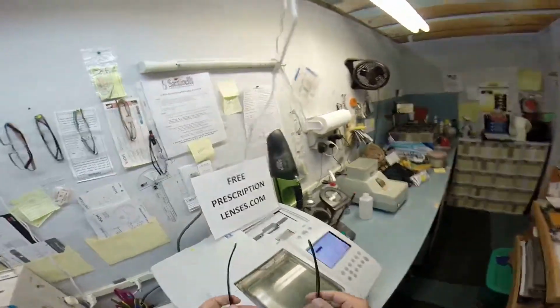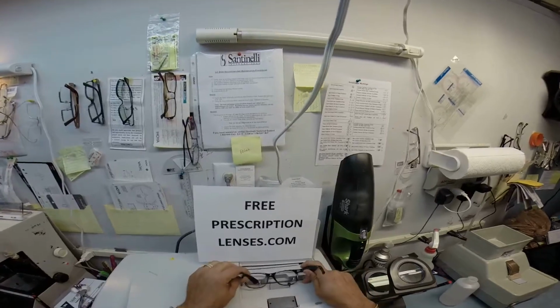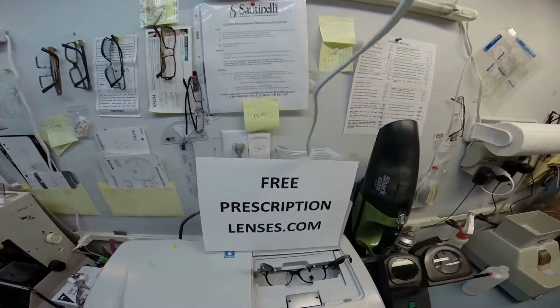I'm going to pop out your original heavy glass lenses that, if you were to drop these on the ground, would shatter like glass would do. And I'm going to put in some lightweight, unbreakable lenses to take the place of the heavy glass breakable lenses.